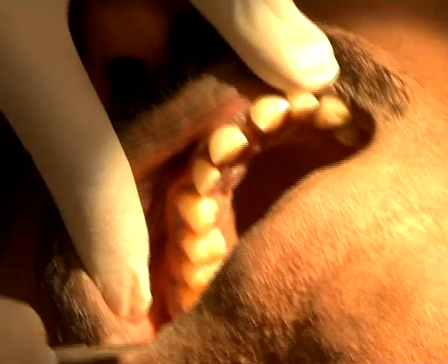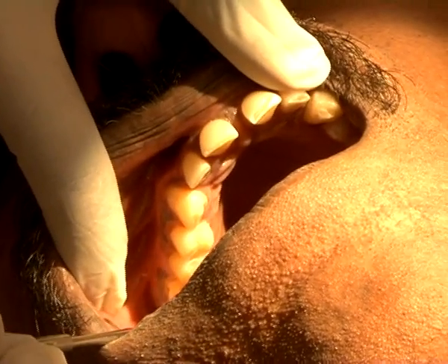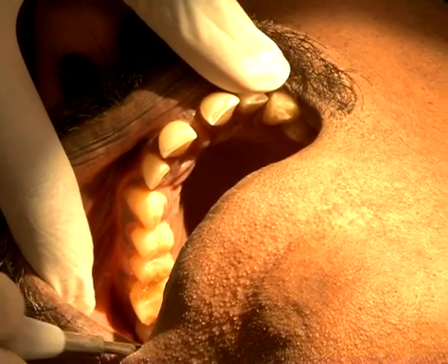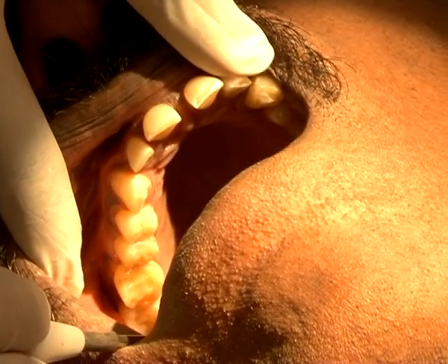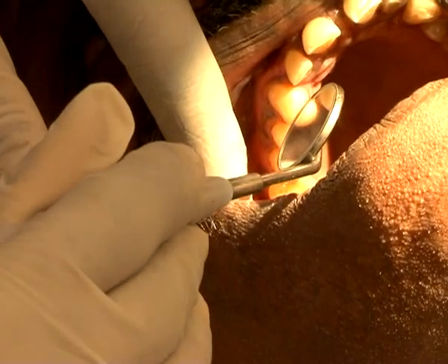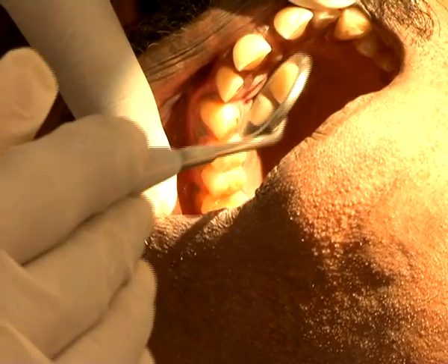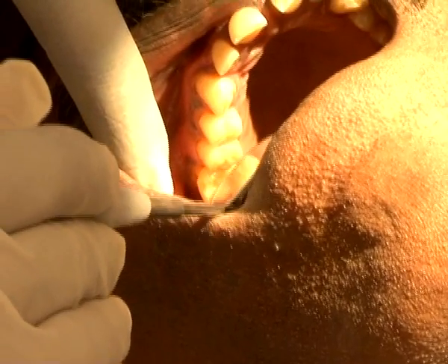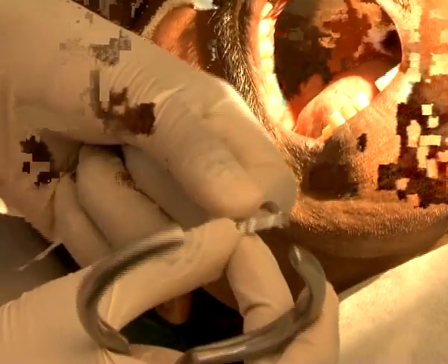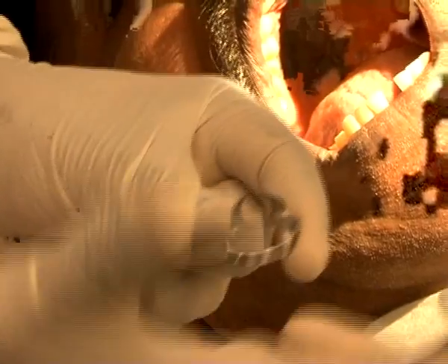We are now going to see an upper multiple tooth isolation. We are going to place the clamp on the right upper first molar and isolate up to the canine. He has a few open contacts in the anterior and very tight contacts in the posterior. We have chosen an appropriate clamp — a W8A clamp, which usually goes very well with an upper molar.